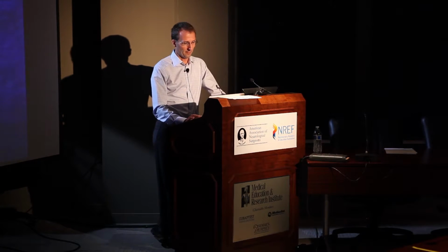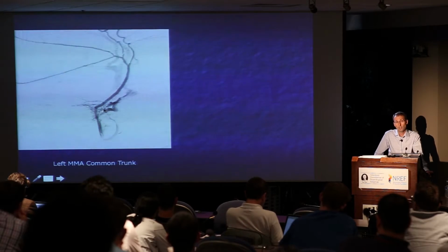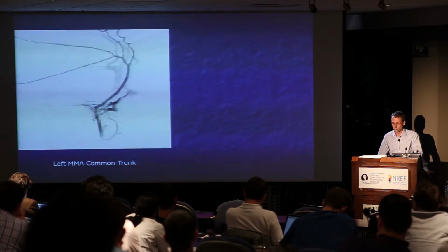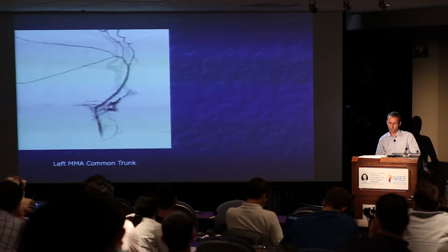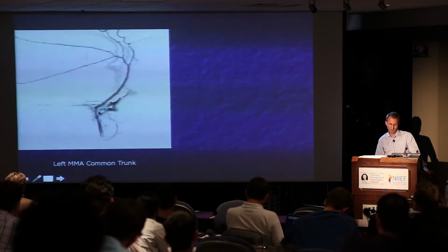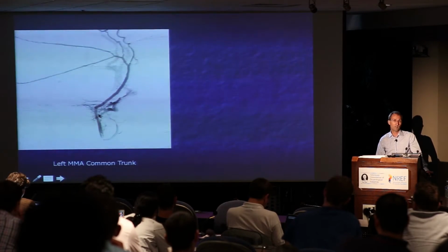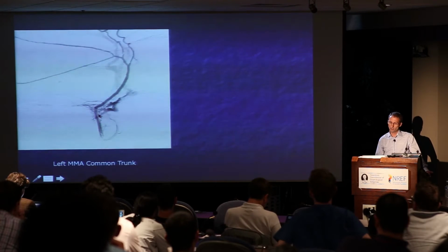But again, this is the area, that thing right there, of the petrous branch of the MMA that we know is going to be supplying the facial nerve. And so I'm not actually super excited about the notion of embolizing this fistula from this location. Yes, you could watch to see if you have any flow to it, but again, with Onyx there's a lot of penetration of tiny vessels that you probably can't visualize angiographically to know when to stop. So I'm not a huge fan of that.